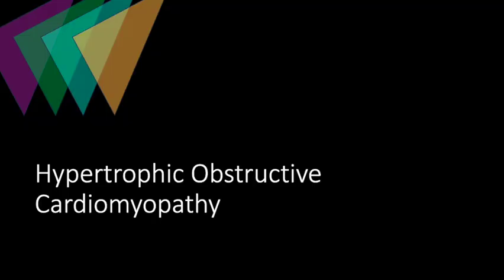Another question that I get asked a lot about for point-of-care ultrasound is using that to screen patients who might screen positive for hypertrophic obstructive cardiomyopathy based on history or physical exam. Let's talk about why this is a problematic use of POCUS.